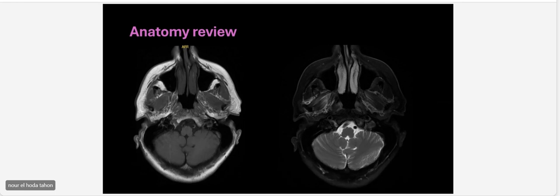Okay, and now this interesting part, the anatomy review. This is very interesting for me, and I hope it is the same for you. I put T1 in comparison to T2 because most of the time you are working with both of them. So here T2, anyone notes anything about T2 here in difference to T1? I know for sure the fluid is bright. It should be. What about the fat here?